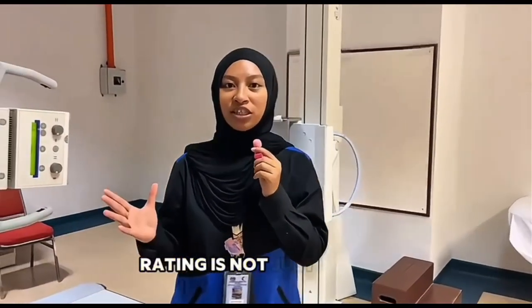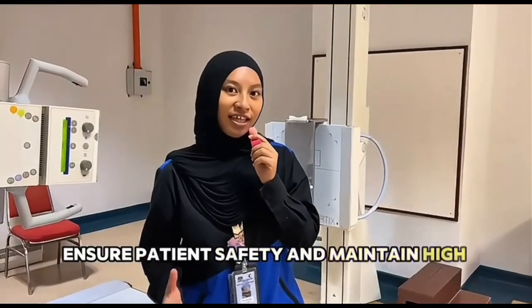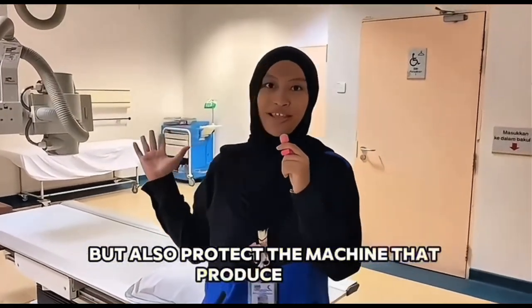In conclusion, understanding heat production and tube rating is not just theory. It helps us protect the X-ray equipment, reduce downtime, ensure patient safety, and maintain high image quality. A knowledgeable radiographer does not only produce images but also protects the machine that produced them.